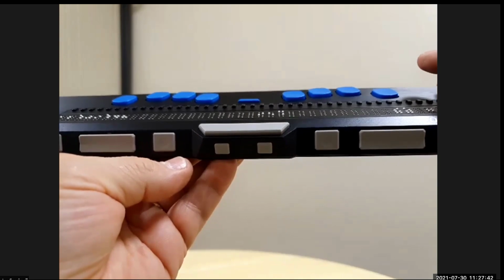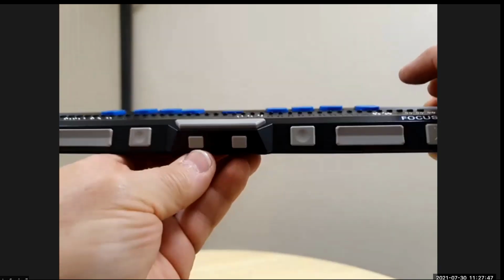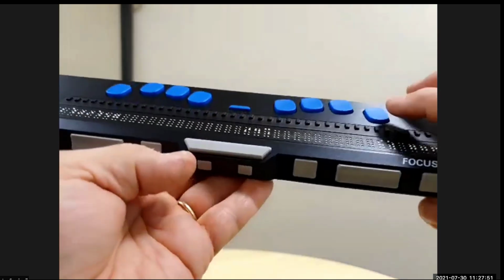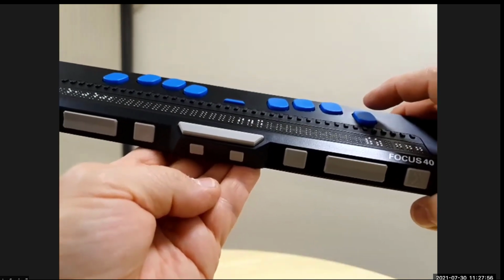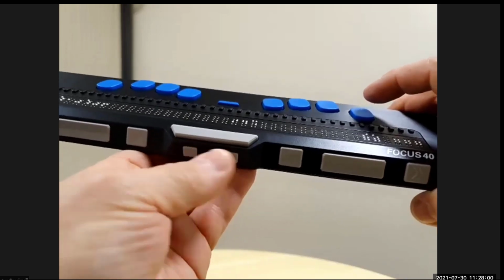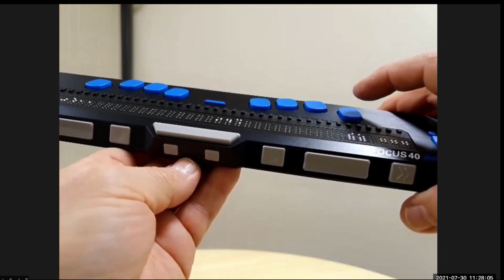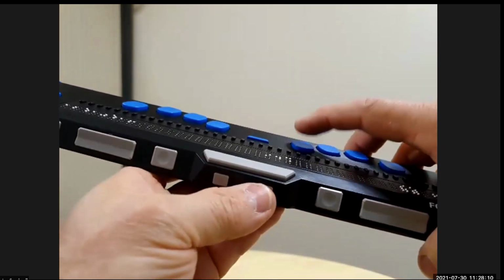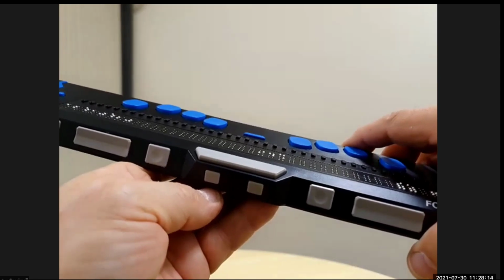Directly below the space bar in the middle, you have the left and the right shift keys. Now, don't be confused. They do not do the same thing as the left and right shift keys on a standard keyboard. You do not use them for capital letters. They're used for commands. So pressing left or right shift in conjunction with something else. So for example, pressing the right shift in conjunction with dot 4 will bring up the start menu or the start screen when you're using this display with JAWS. So don't get them confused with the left and right keys on your number pad.